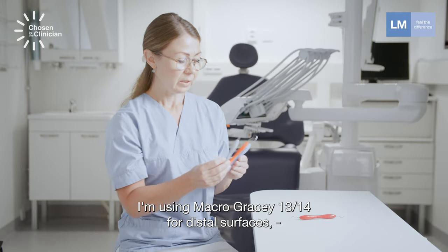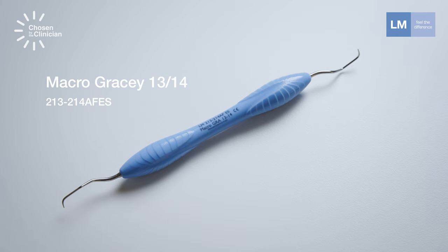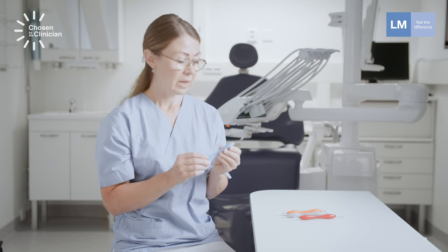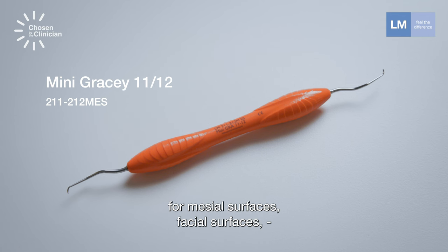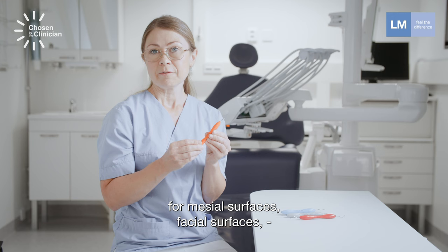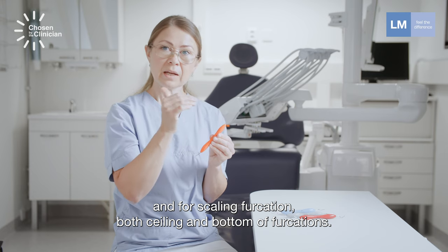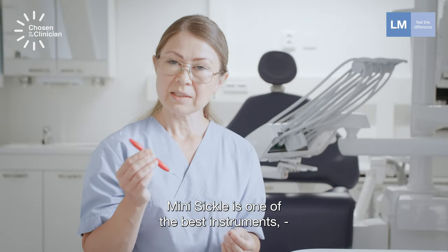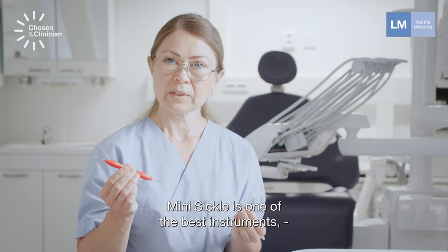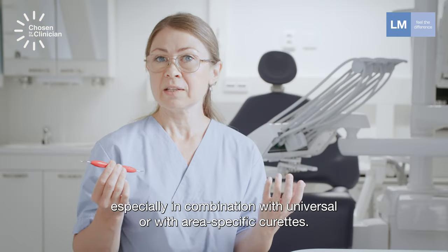I'm using Gracey 13-14 for distal surfaces, for vertical and horizontal strokes. I'm using Gracey 11-12 for mesial surfaces, facial surfaces, and for scaling furcations — both the ceiling and bottom of furcations — and mini Gracey 1 and 2.